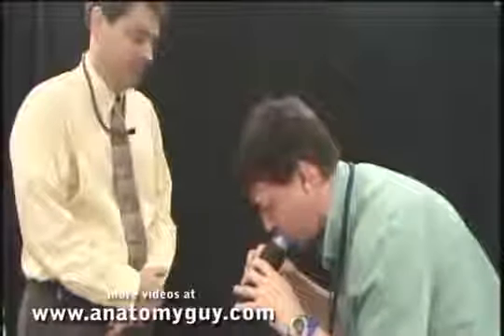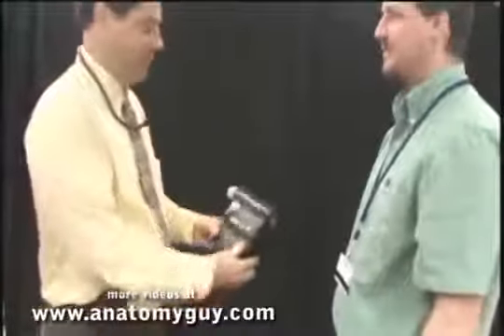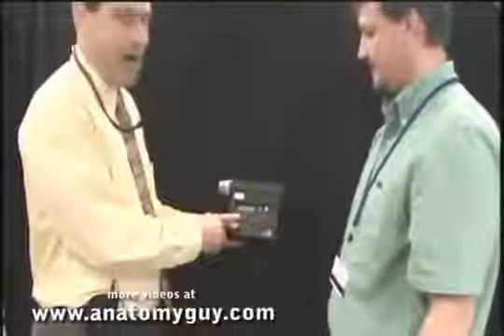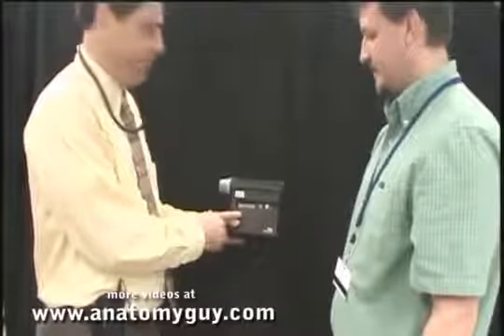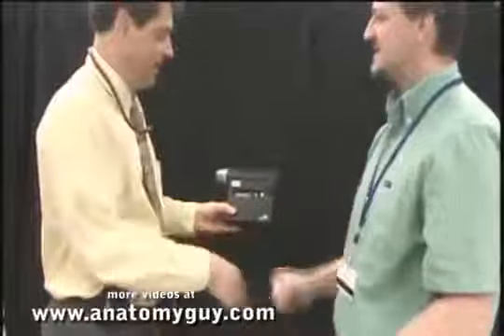Blow, blow, keep on going, more, more, keep going, keep going. The machine will beep when he's done. Keep going, that's it. If you notice, this is effort dependent. The machine automatically will tell if there's poor effort or if there's a cough. This one, he did a good job, congratulations.